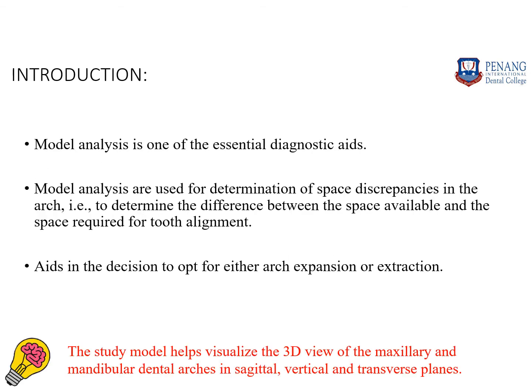A brief introduction. Model analysis is one of the essential diagnostic aids. It is used to determine the difference between the space available and the space required for tooth alignment. So basically, it helps in the determination of space discrepancies in any of the arches and also aids in the decision to opt for either arch expansion or extraction.